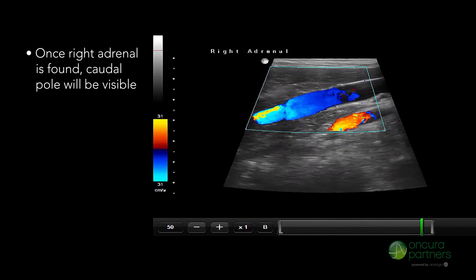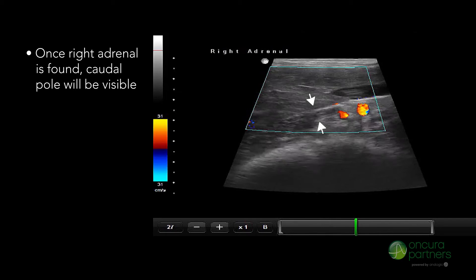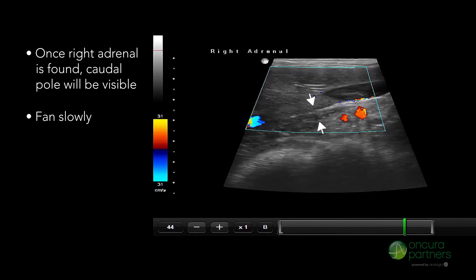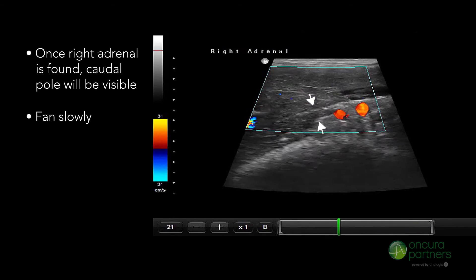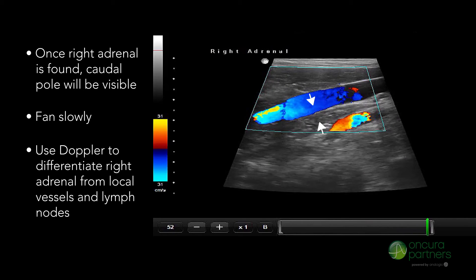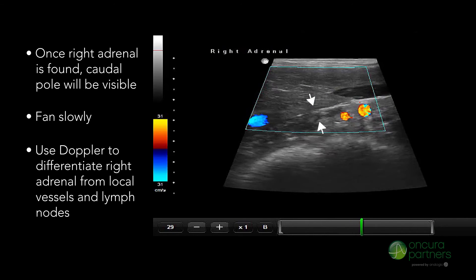Once the right adrenal gland is found, the caudal pole will be visible. Very slow fanning is highly recommended, as rapid fanning will make identification of this small organ difficult. It is also very important to use Doppler to identify and differentiate the right adrenal from local vessels and small lymph nodes.